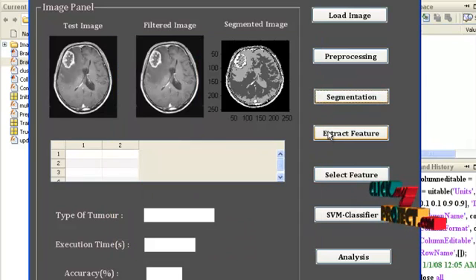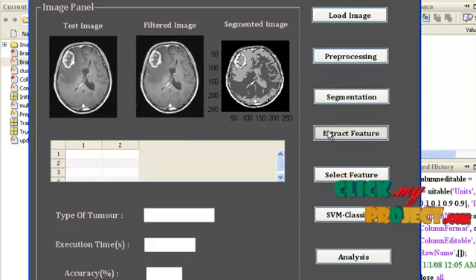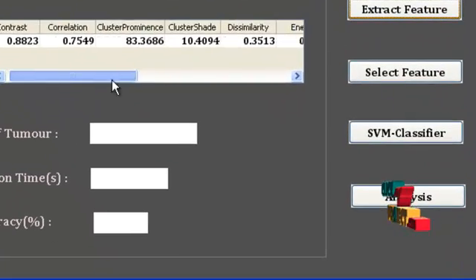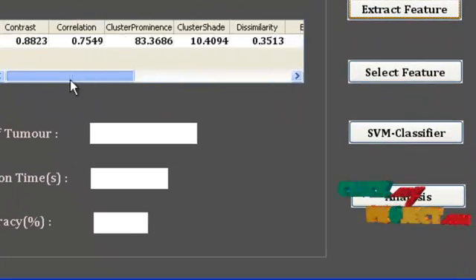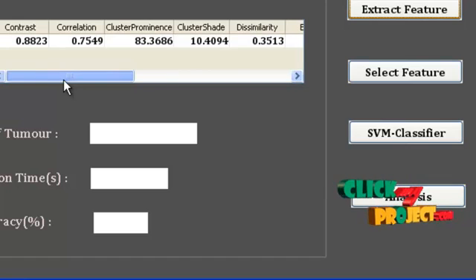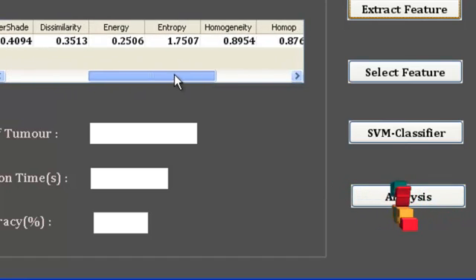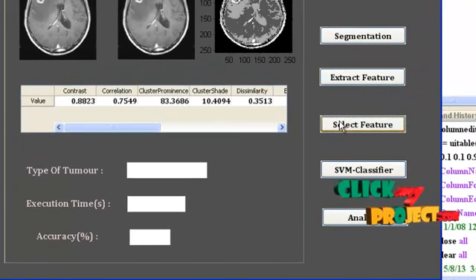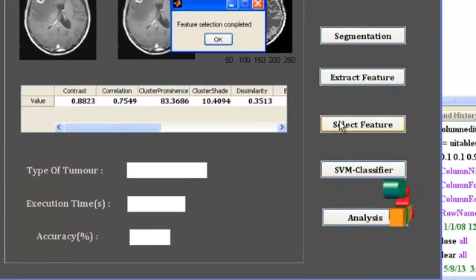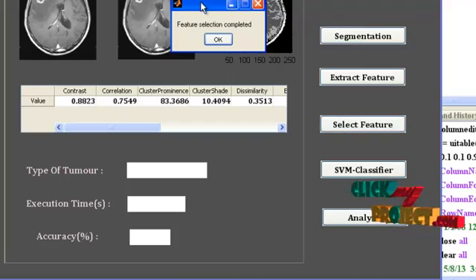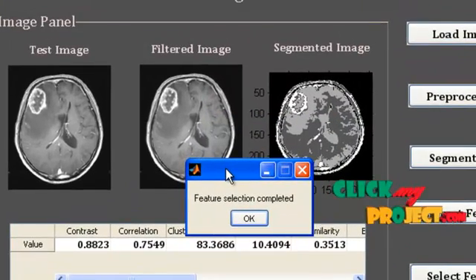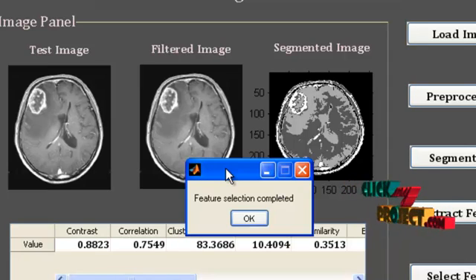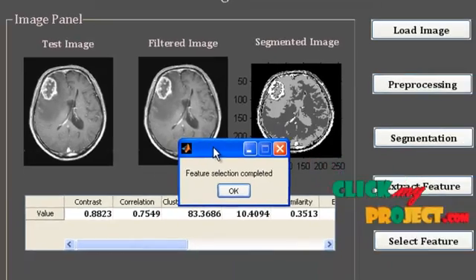Come to the next one — extraction of features. After pressing this button, the features are tabulated, including contrast, correlation, cluster prominence, cluster shade, and so on. Next, press the button select feature. After the selection of best features by the sequential forward selection algorithm, the message box shows the completion stage.